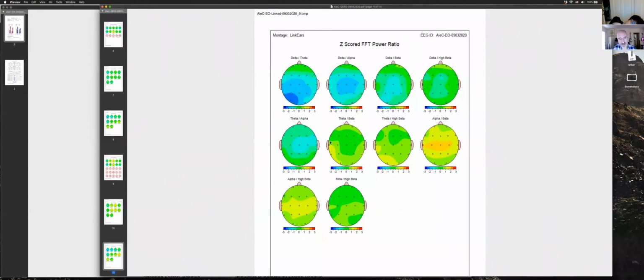When people have ADHD, these heads here are bright red. You don't have classic ADHD. Wow. When people have ADD, inattention, 80% of the time, this head is red. And sometimes this head here. So something's happening for you, producing some inattention right there. But you know what? It's not everywhere. It's just kind of right in this left side. And that's a particular circuit in the left side.